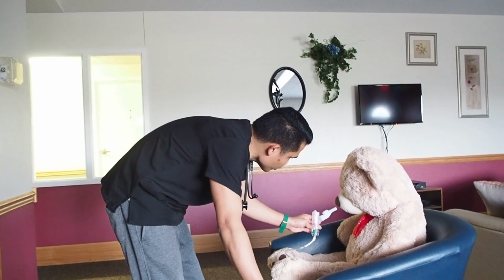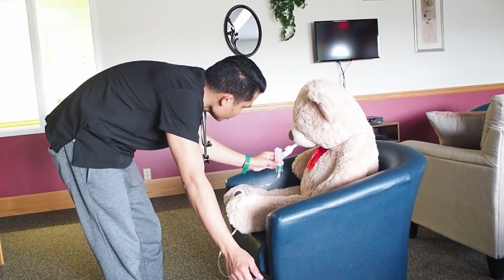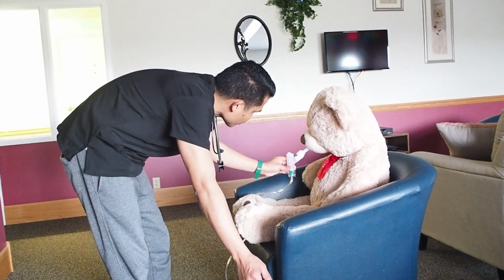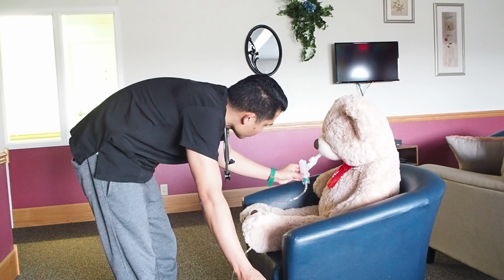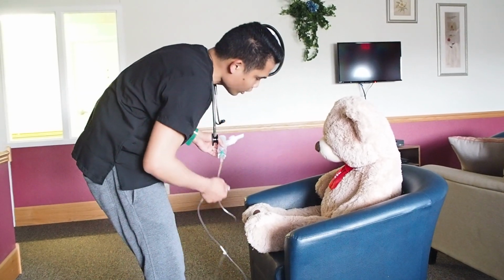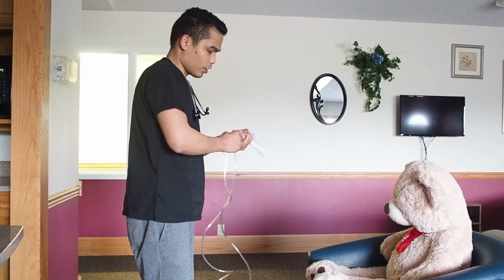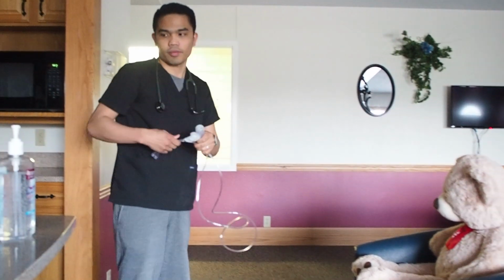So put this inside your mouth with your lips sealed, and then do normal breathing with occasional deep breaths. Okay. Okay. So I think we're done with this nebulization. I will just let you rest for a minute for the effect of the medication while I'm preparing for the next breathing treatment.